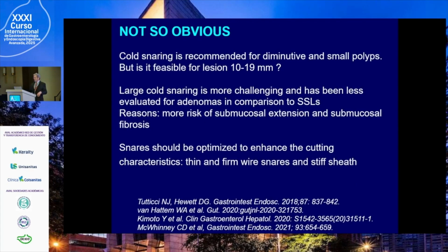And it is not so obvious because large cold snaring is very challenging, okay? In adenoma, in comparison to sessile serrated lesions, you have more risk of submucosal extension and submucosal fibrosis, and the snare should be very good, should be optimized. And so that's why I really prefer to do ESD.